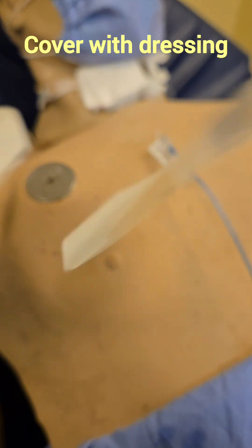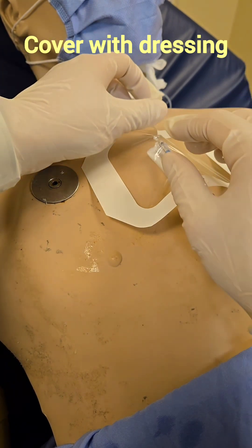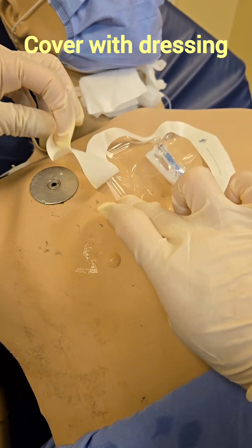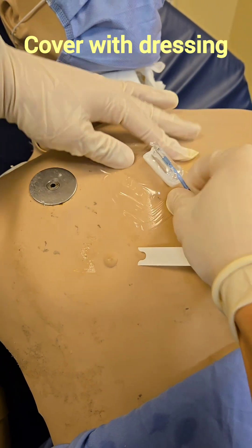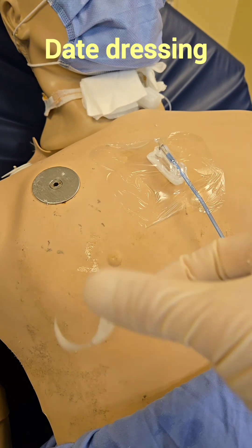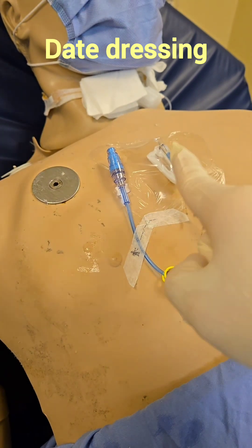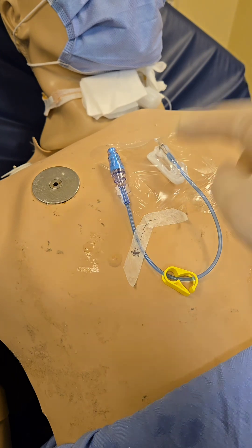Now let's apply our dressing. Portacaths are the only central lines where it's okay to have tenting — meaning the dressing will be raised up — because the portacath is quite chunky. On a PIV or other central lines such as PICCs or IJs, you should not have tenting. You can also use other types of dressings, such as central line dressings, if the patient is more diaphoretic. Make sure to put the date and time of when you accessed it. Most institutions, including ours, require the portacath dressing to be changed every seven days once it's been accessed — check your hospital policies.